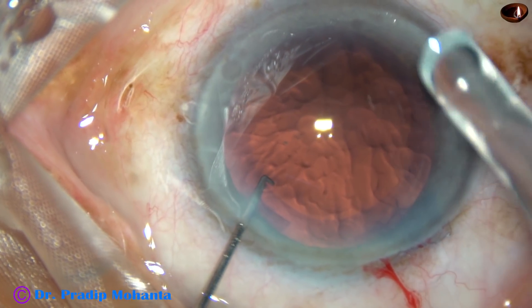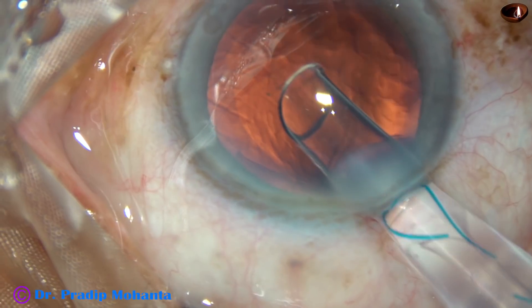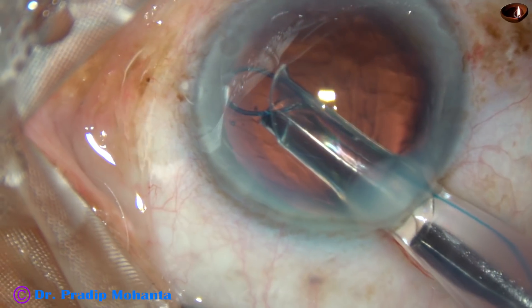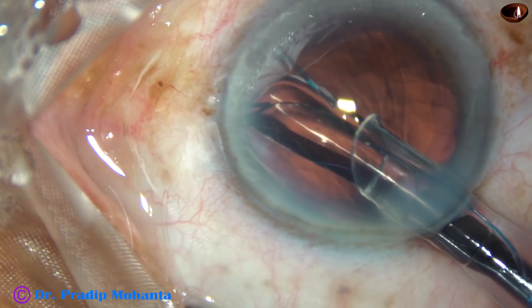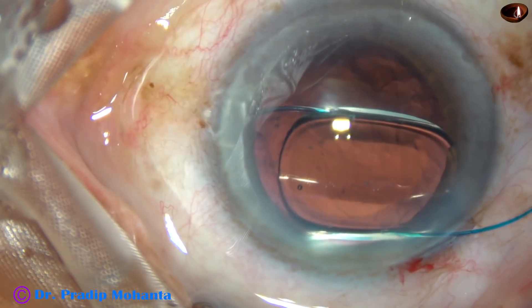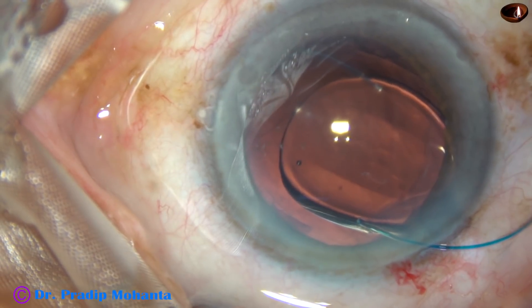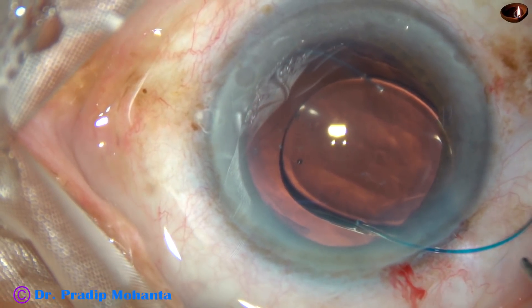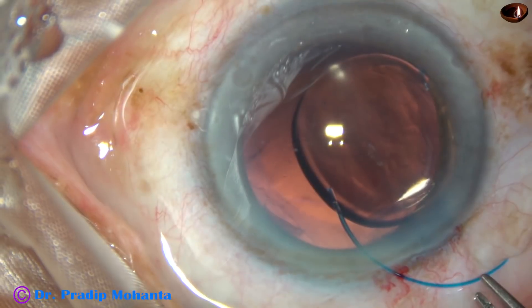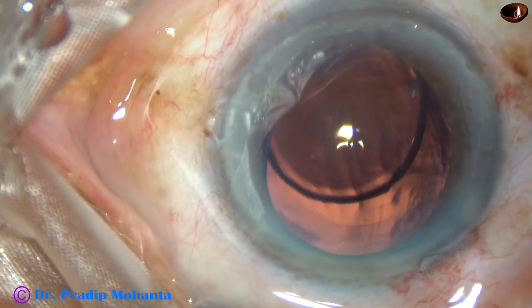Then I can place the haptic over the anterior capsular rim. Here it is — it is going over the anterior capsular rim and behind the iris. That means it is going into the sulcus. And now I am going to inject some more visco over the anterior surface of the lens, and then I am going to use a Macpherson's forceps to place the haptic in the sulcus.